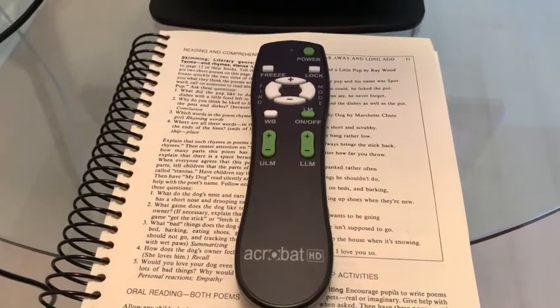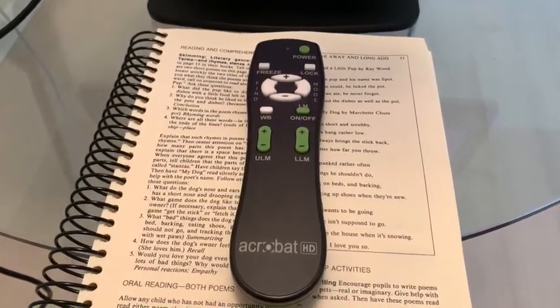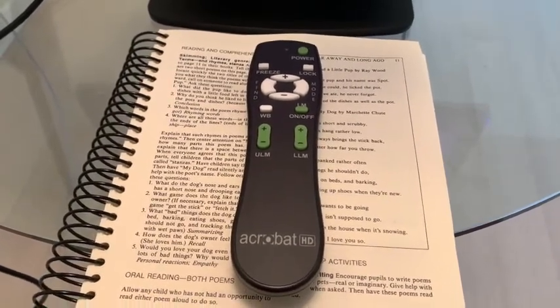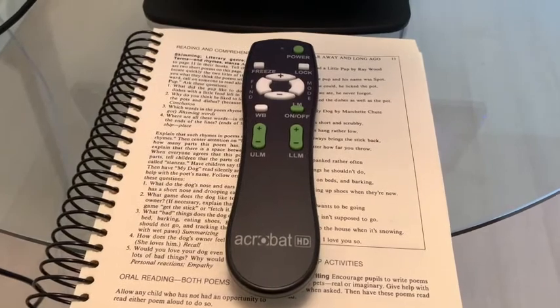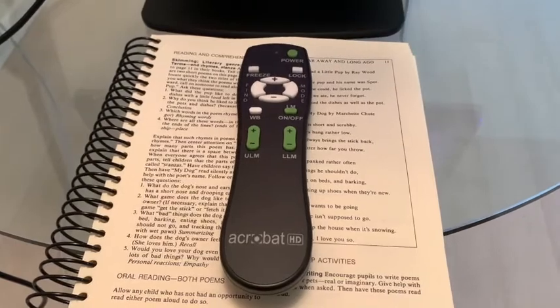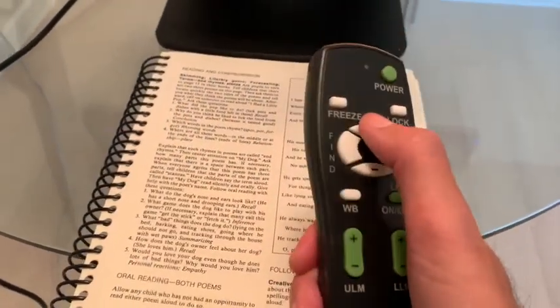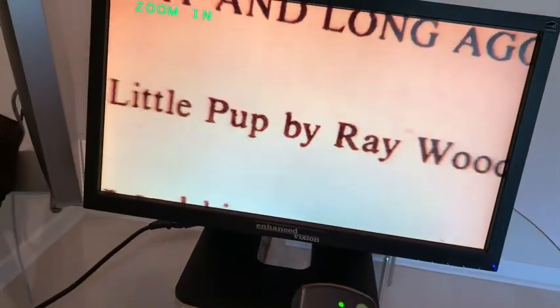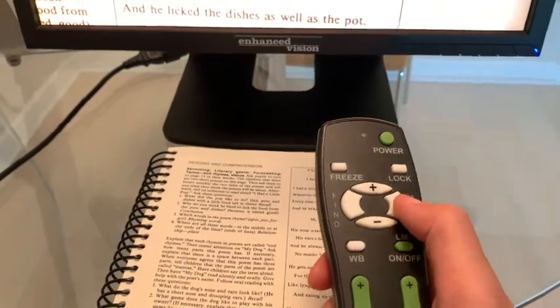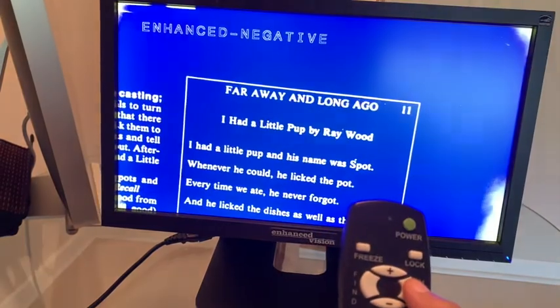You can also use the remote to go through all the different functions. Just make sure the unit is powered on in the back with the switch, and then you can turn the power on or off with the remote. You can still use the magnification levels and the mode button using the remote.